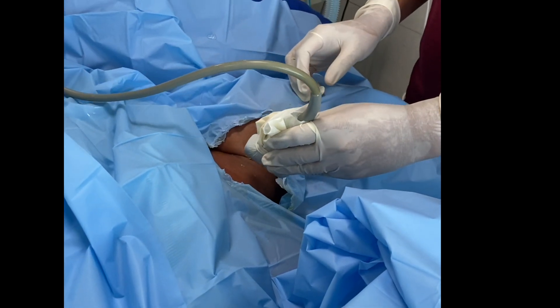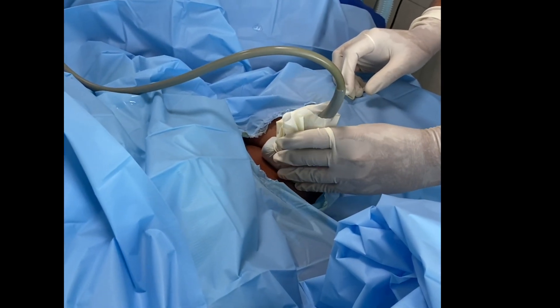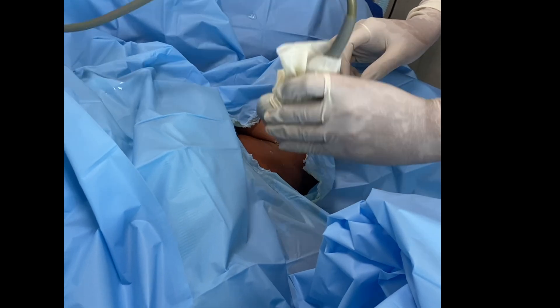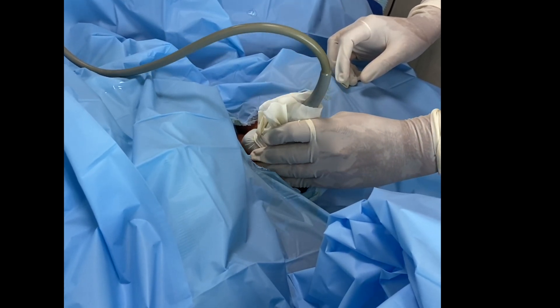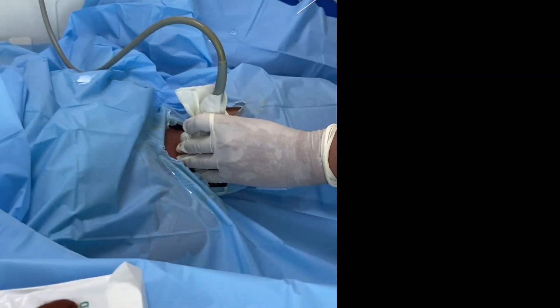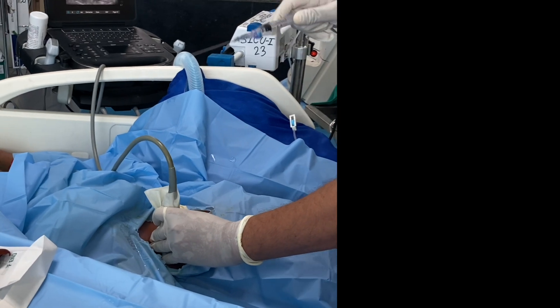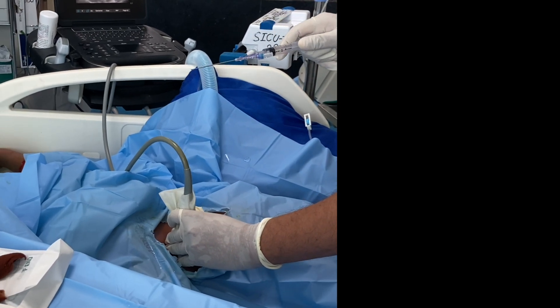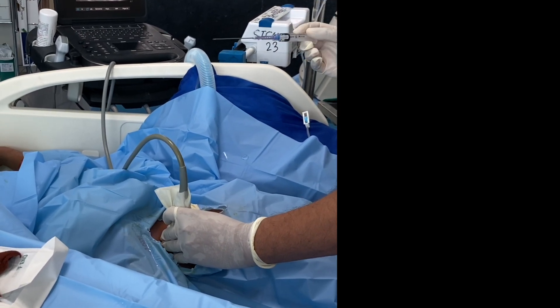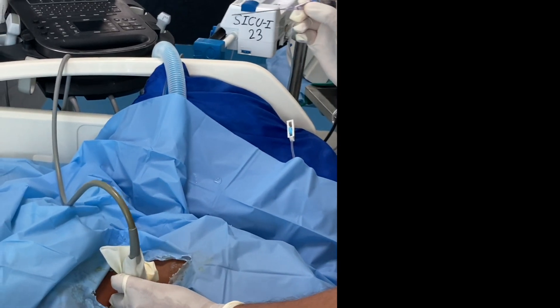The method is known as Dynamic Needle Tip Positioning, in which we basically find the needle tip by moving the probe distally and cranially. Usually we hold the needle like a pencil, and in dynamic needle tip positioning we also hold the needle like a pencil.